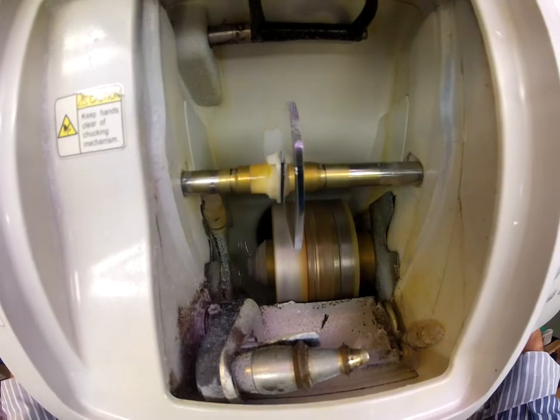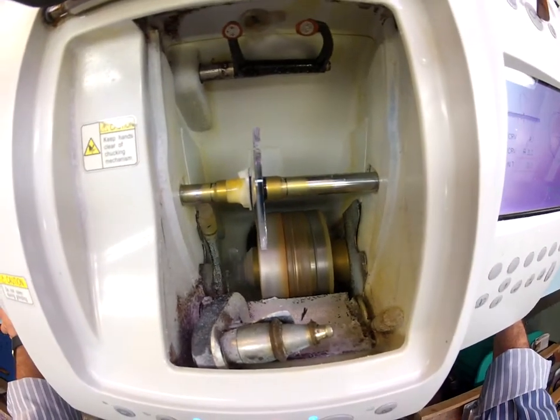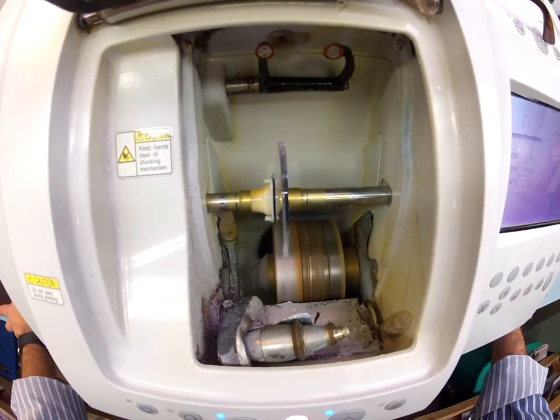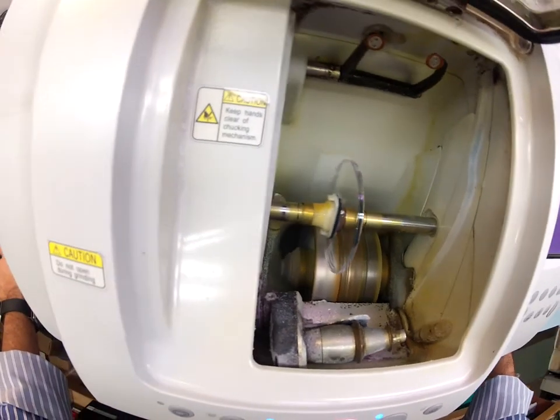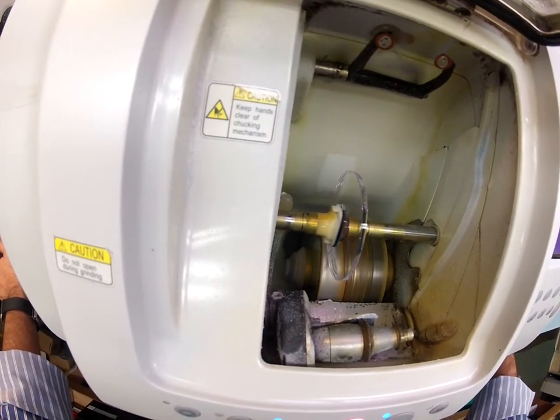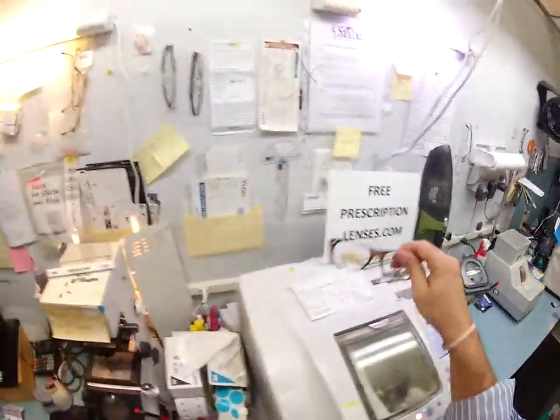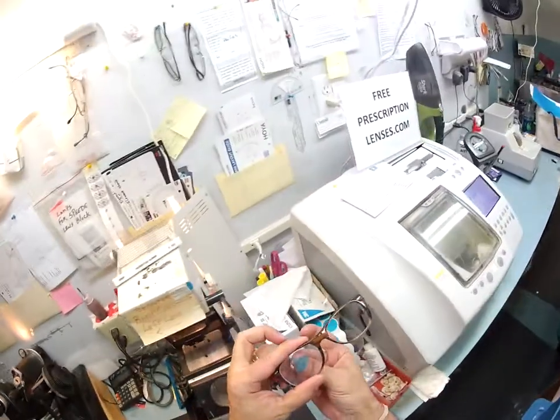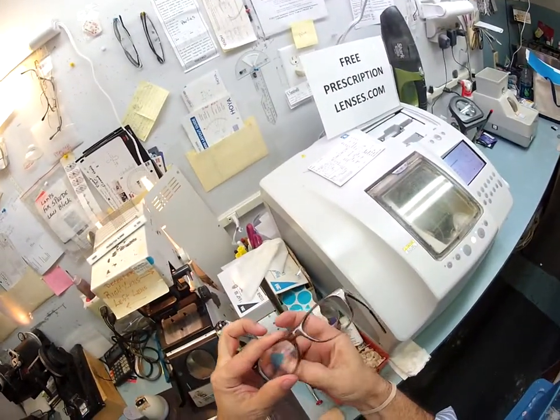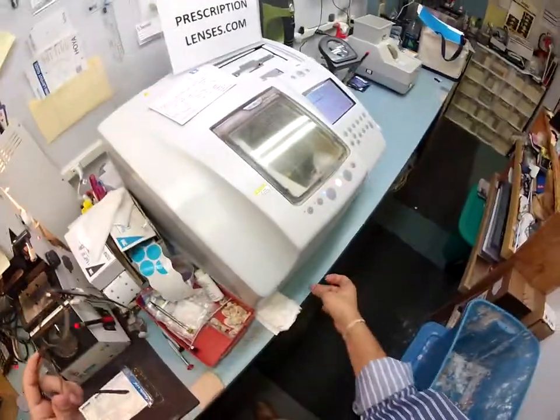Fire up old cutting wheel. There we go. Spin, spin, spin. Once that touches down, I'm going to continue working on your right lens. And they're off. So this block is no longer needed. I'm going to pop this off. Pull this blue sticker off now that that's no longer needed. Put that there.